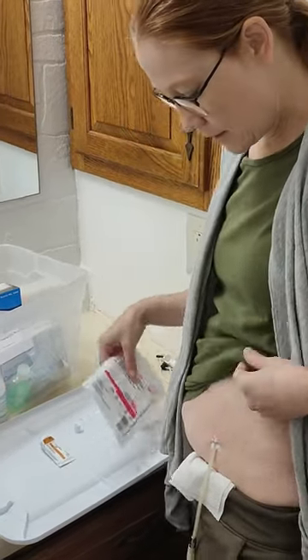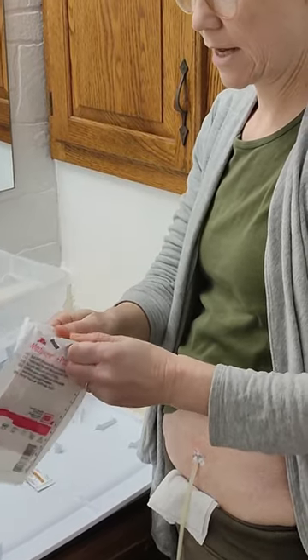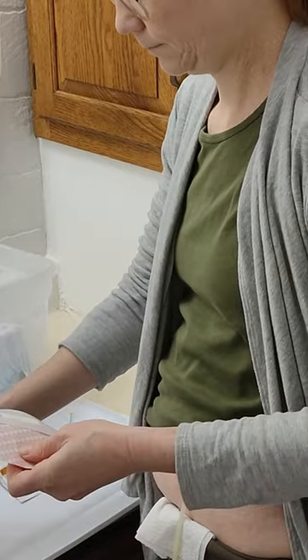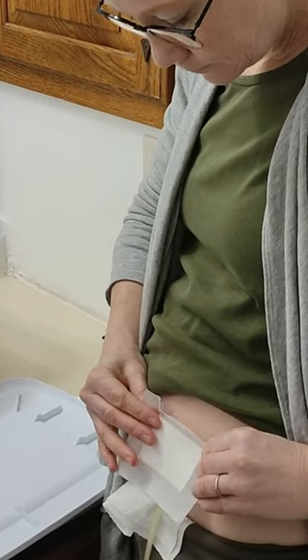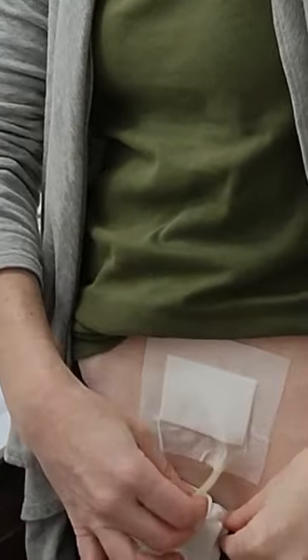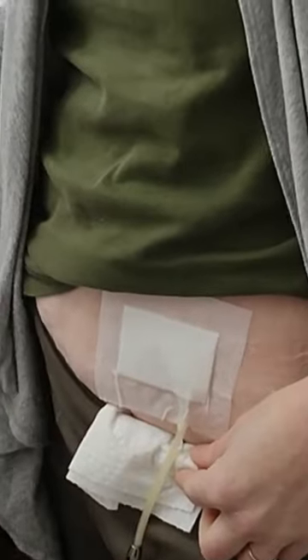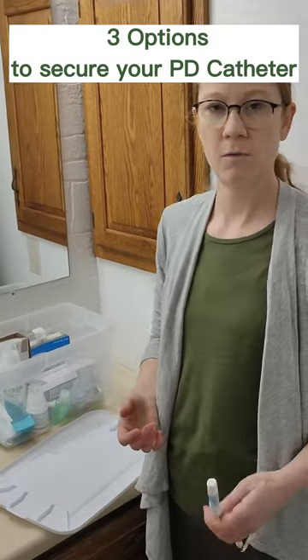Then finish off with a new bandage. Something that I've learned is I go and I pinch it around where the tube comes out so that it won't pull up on the bandage, and kind of open it up. And then I'm done.